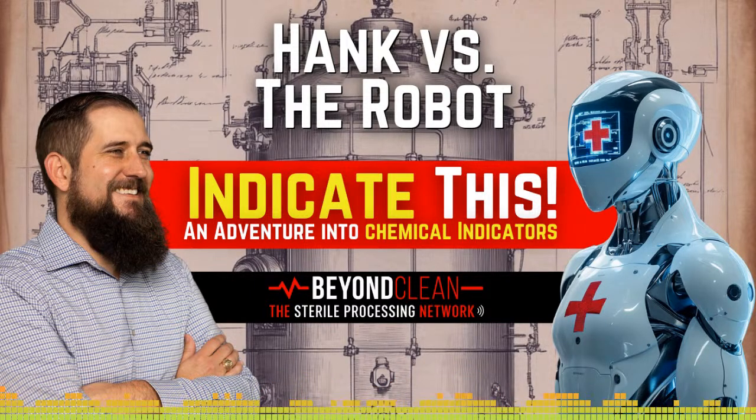Quality control. Before they leave the factory, these products undergo rigorous testing to ensure consistency. Batch testing is conducted to confirm that the color changes or reactions happen within specified parameters. For integrators, this includes verification that they won't give a false pass if conditions aren't met. Finally, the indicators and integrators are packaged in sterile or contamination-resistant materials to ensure they arrive ready for use. They're also labeled with clear instructions and expiration dates to help SPD techs use them correctly. To sum it up, these products are like tiny science labs on strips of paper or plastic, engineered to withstand the rigors of sterilization cycles and give you crystal clear results.